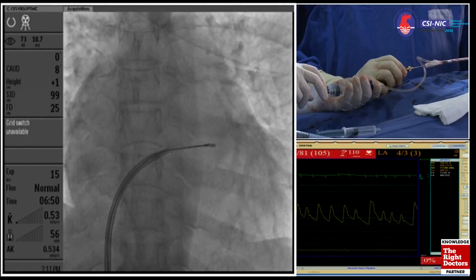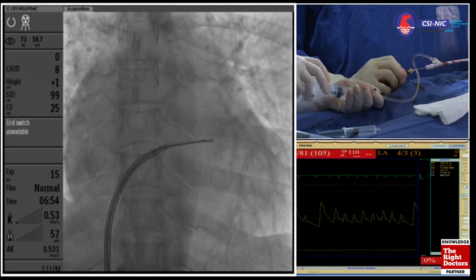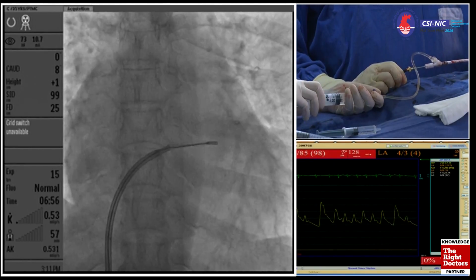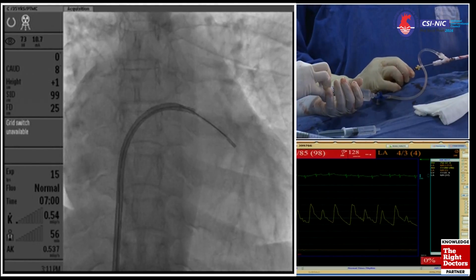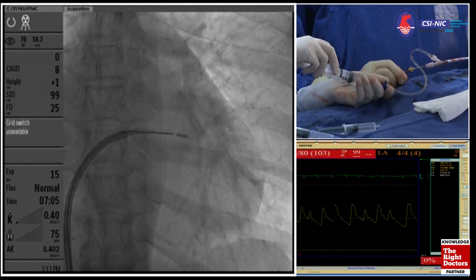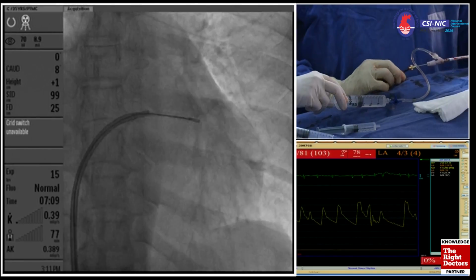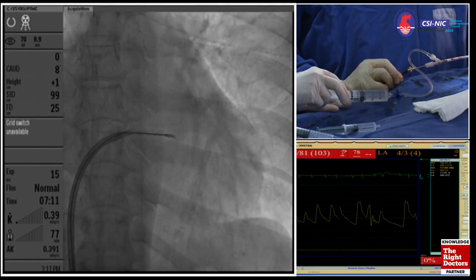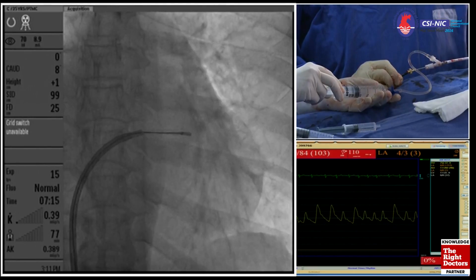What about the heparin? Have you already given the heparin? Yes, Dr. Manjunath, heparin 3000 units we have given, before septal puncture only. Sometimes you can give it after septal puncture too. So you can always watch for this bobbing movement. That means you are on top of the mitral valve.